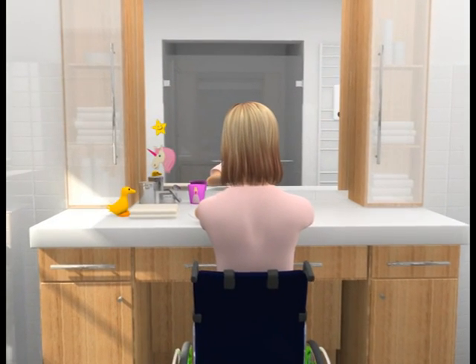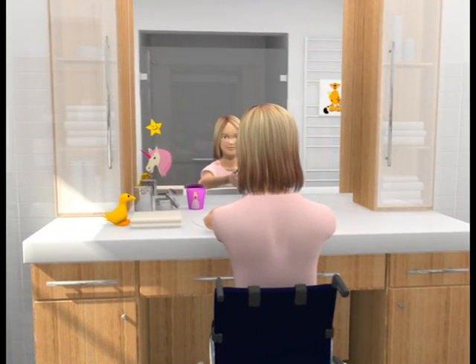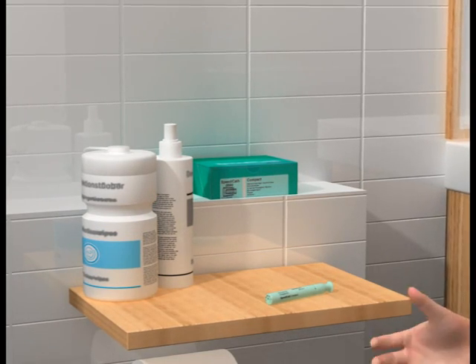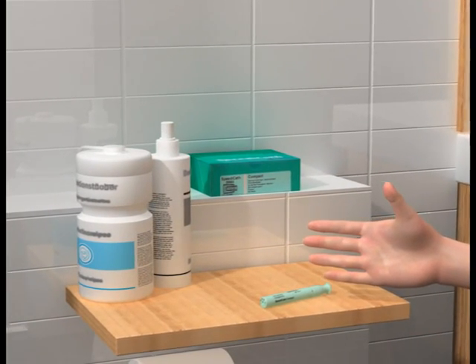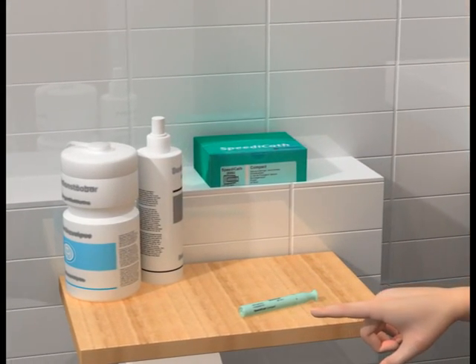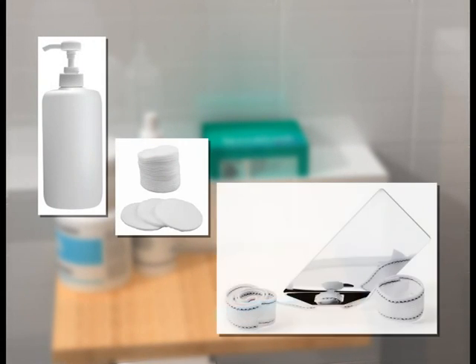Always start by washing your hands with soap and water. Don't forget your thumbs. Make sure you have everything you need before getting started. You will need a catheter that's the right size, some mild soap, some cotton wool pads, and perhaps a mirror which can be fastened onto your thigh.